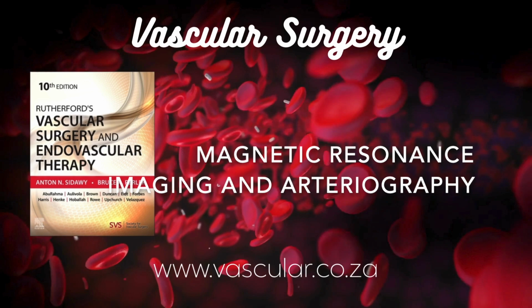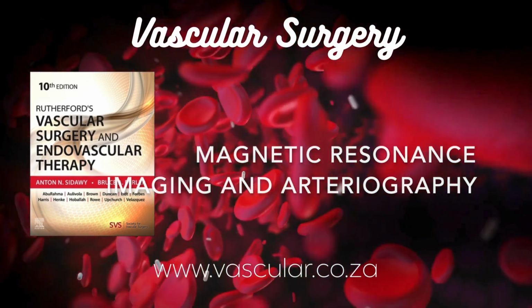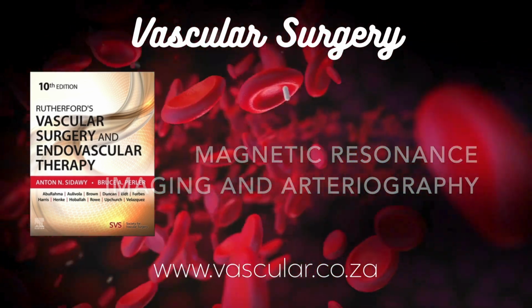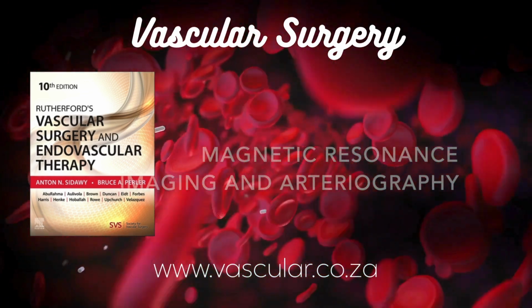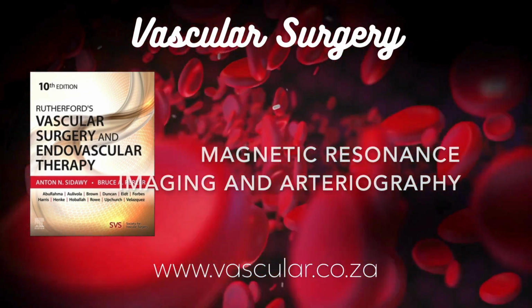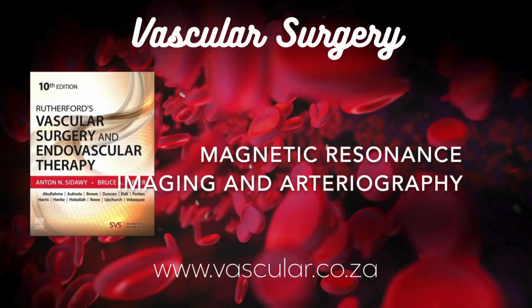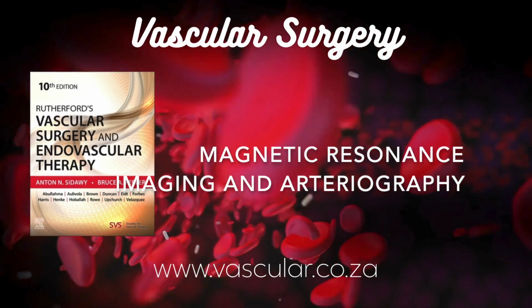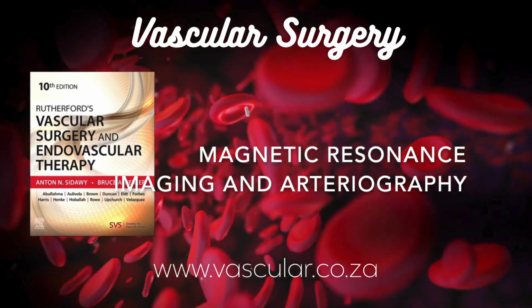Are all gadolinium agents the same risk? No. There are different chemical structures. The macrocyclic agents seem to hold on to the gadolinium much more tightly than the older linear agents. So macrocyclics are safer. They have a significantly lower association with NSF. Current guidelines strongly recommend using only macrocyclic agents in patients with severe kidney disease, and only if absolutely necessary at the lowest effective dose. And for dialysis patients, dialysis soon after the scan is often recommended to help remove the agent. So for these patients, non-contrast MRA or maybe CTA is often preferred. Absolutely. Avoiding gadolinium altogether is the safest bet if kidney function is very poor and a non-contrast alternative is feasible.